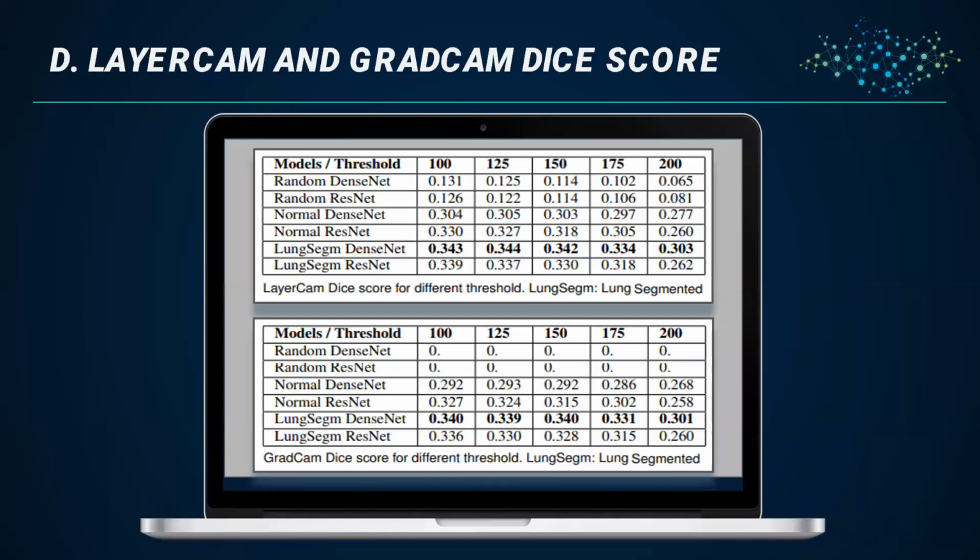The threshold value has a critical role in measuring the GradCAM and LayerCAM methods. The success rate varies according to the threshold value determined. Performing analysis using equal and frequent intervals is very costly. Testing a threshold value with each model takes approximately 2 hours. Since there are 6 models, this takes 13 or 14 hours in total. In order to minimize this cost, 5,000 images were analyzed.